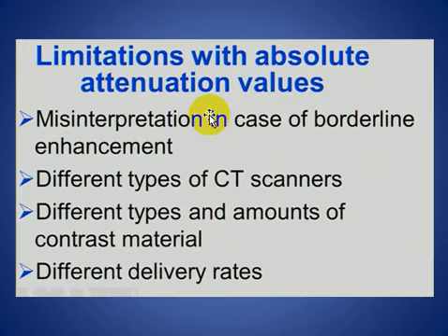Limitation with absolute attenuation value: misinterpretation in case of borderline enhancement, different types of CT scanners, and different amounts of contrast material and different delivery rates.